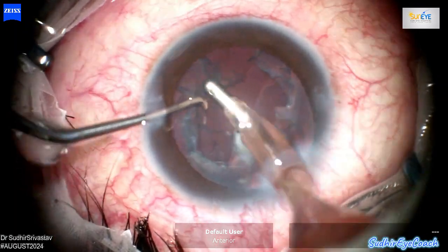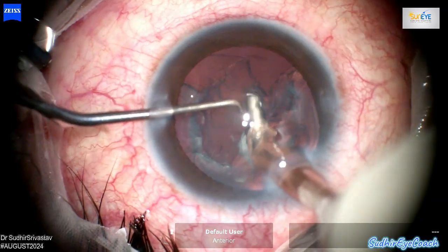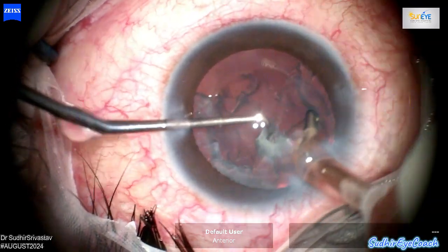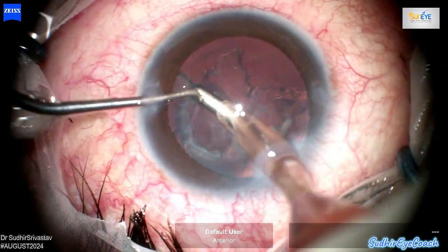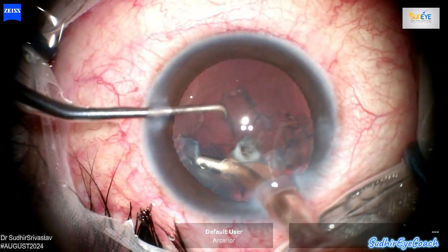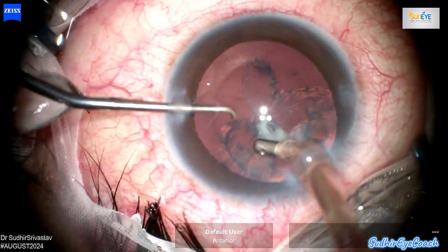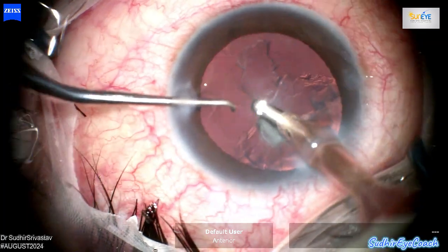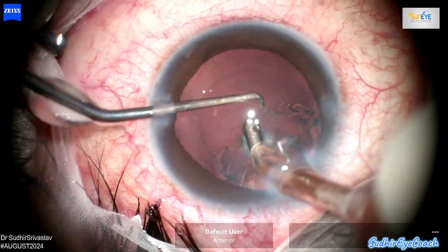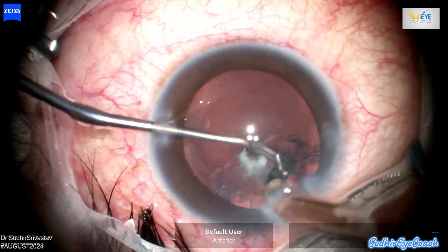I am now using coaxial I/A for the cortical removal. Beginning from the periphery, my approach is to gently drag the cortical matter from periphery towards the center. This allows safer and more controlled aspiration. Always address the area around the tear last. If you attempt to aspirate cortex near the tear too early, you risk pulling vitreous into the anterior chamber, which not only complicates cortical aspiration but can also extend the tear, making the procedure more challenging.